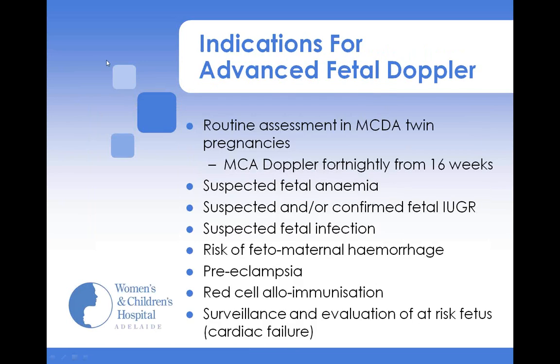So some of the indications for advanced fetal Doppler. As mentioned, it's used in a routine assessment of monochorionic twin pregnancies. And the protocol is, on top of the growth and deepest pool, we will perform an MCA Doppler fortnightly from 16 weeks onwards.